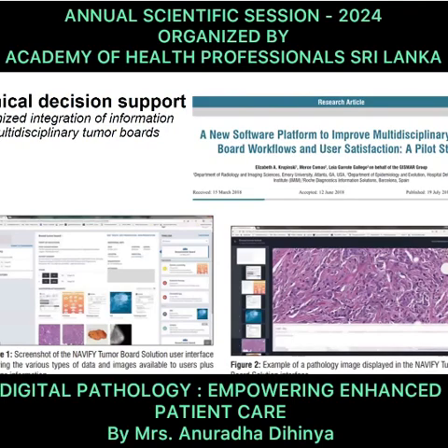Coming down to the clinical decision support, if you're planning to go ahead with digital pathology in your country, it does have added value. Suppose you are having a tumor board meeting, your digital images can be shared with the clinicians and the radiologists via a link generated from the software itself, and access can be given.